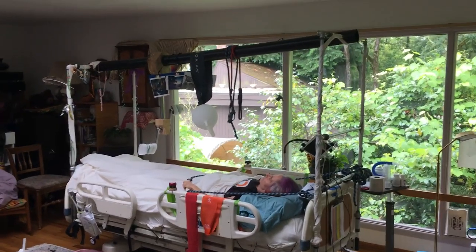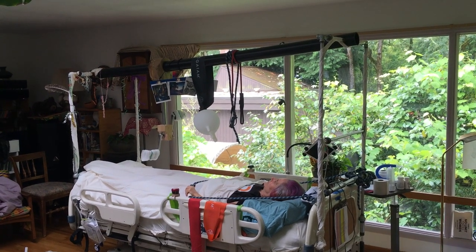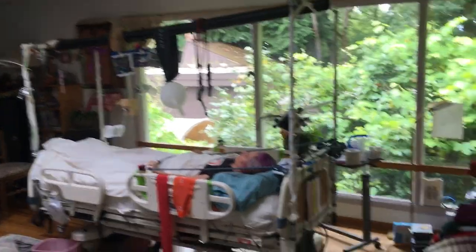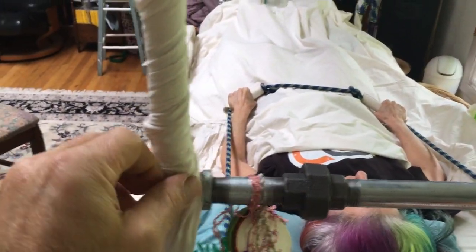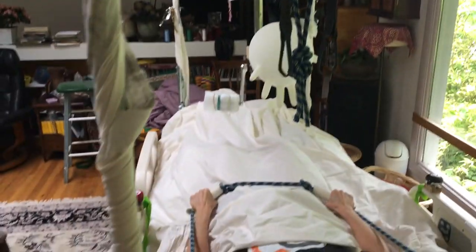This is an introductory video on how to make an exercise and health trapeze system for a classic Stryker medical bed. All the parts here are made out of classical pipe fittings. This is what's called a union. This is all half-inch steel pipe, and each of the crossbars has a union.